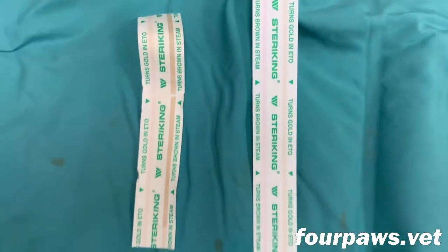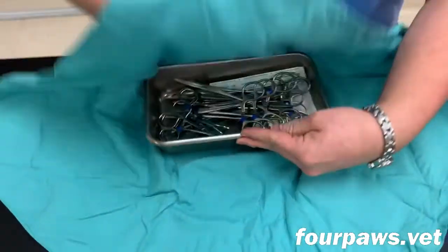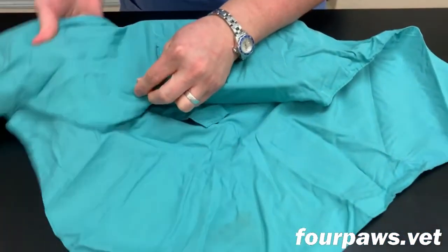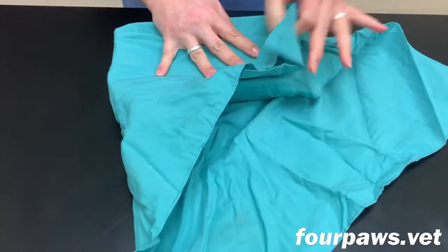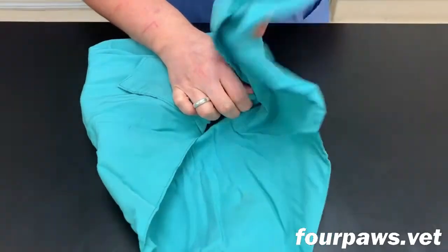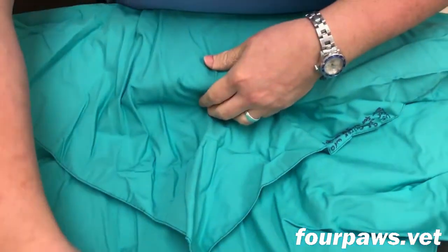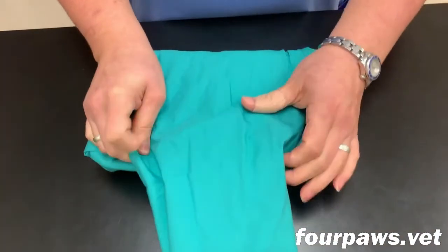Once the tray has been filled with the correct instruments, an indicator strip, and the correct number of gauze sponges, it then needs to be wrapped in these cloth drapes. Most surgical packs are double wrapped, and there's a very specific technique that needs to be used in order to wrap them properly. As the second wrap is completed, there's a small pull tab that's left in order to facilitate the appropriate way to open the pack.